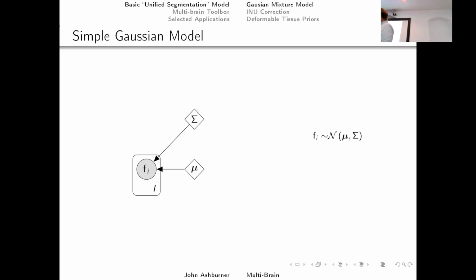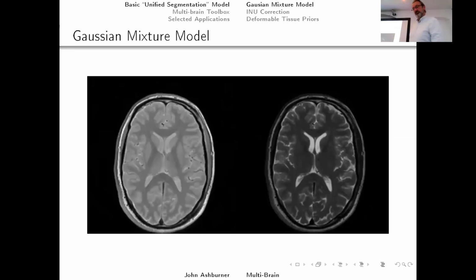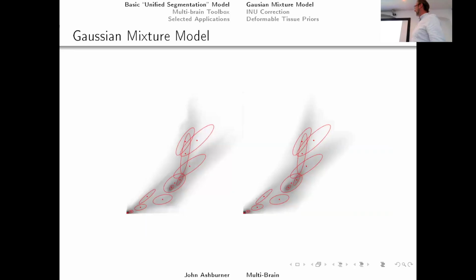We've got our data F, which could be an image of Gaussian random noise, or a multi-channel image with random noise with a particular covariance matrix. And I indicates the number of voxels. So that's starting simple, but with real images, it's not random noise.